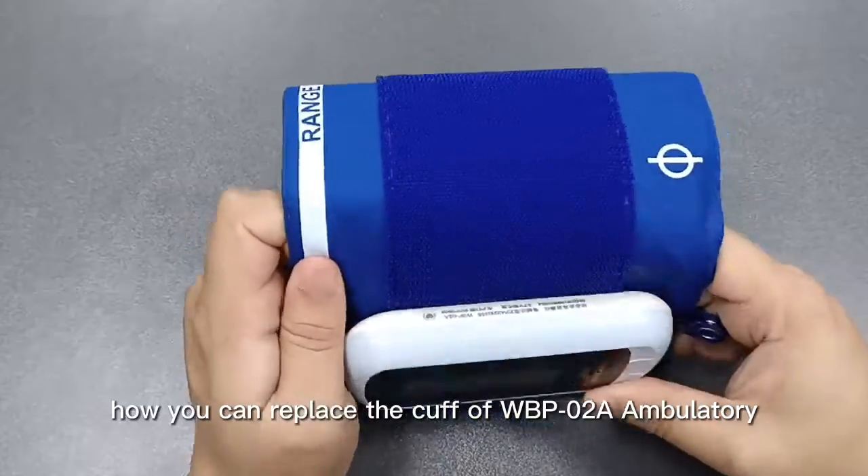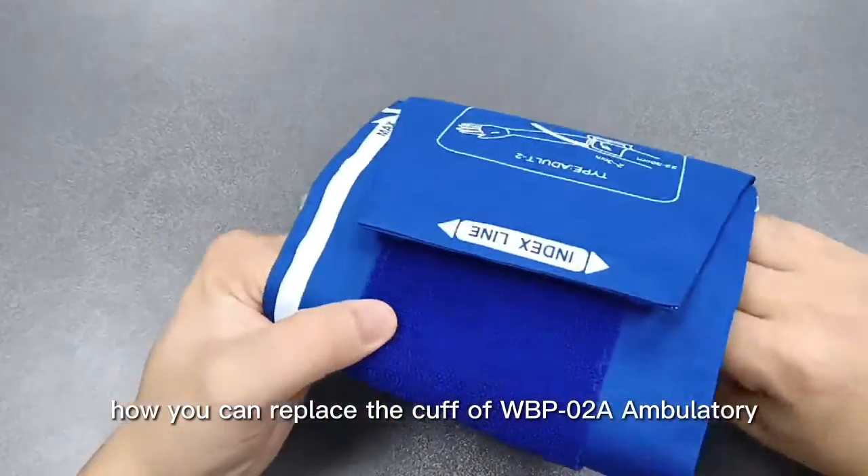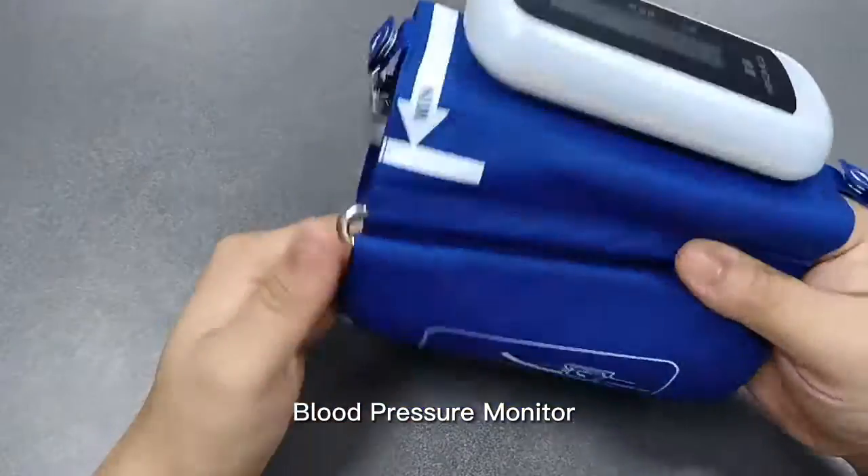Hello everyone, today I will show you how you can replace the cuff of WBPO2A Ambulatory Blood Pressure Monitor by yourself.